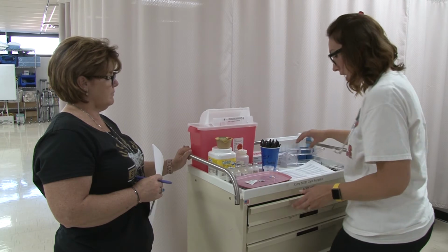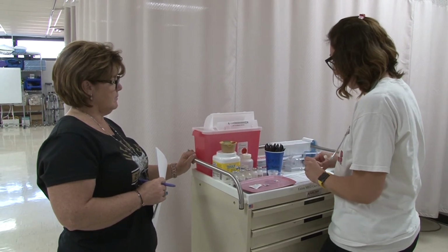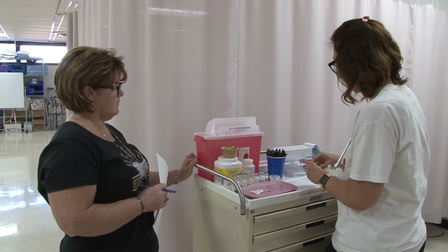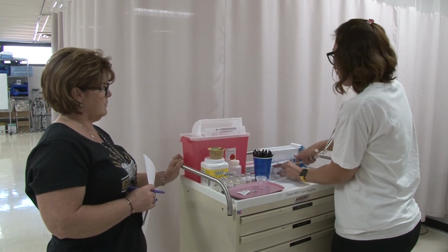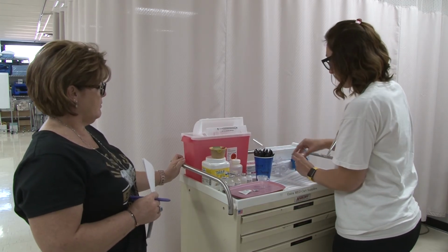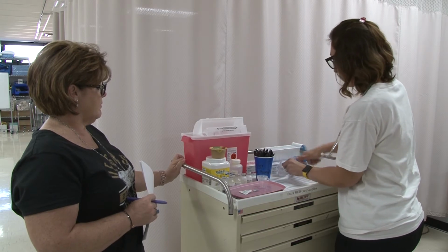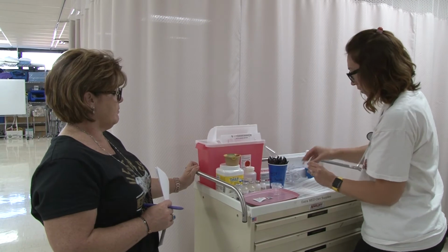Okay. Now I'm going to put these in 2 little cups so that I can crush them. Because it's Gtube, I want to crush it as fine as I can. I might have to move it around a little bit.